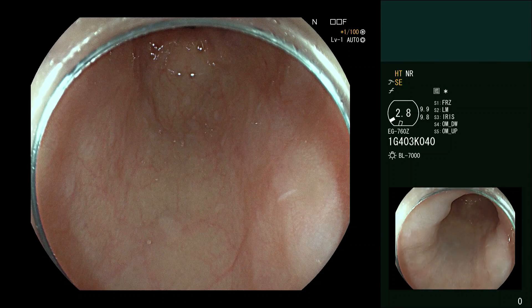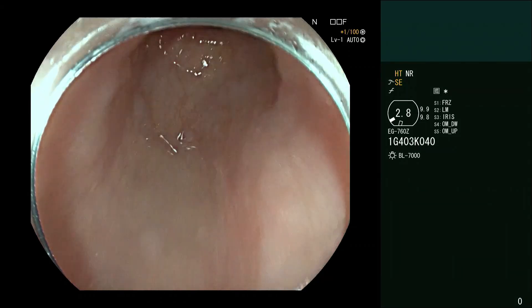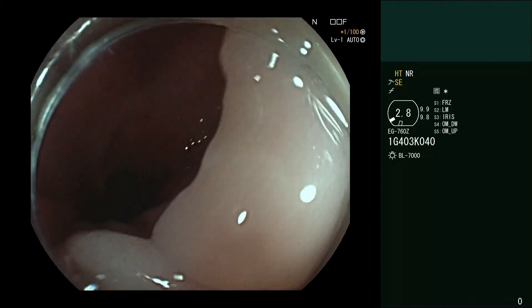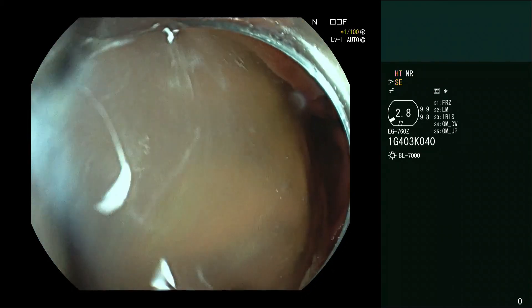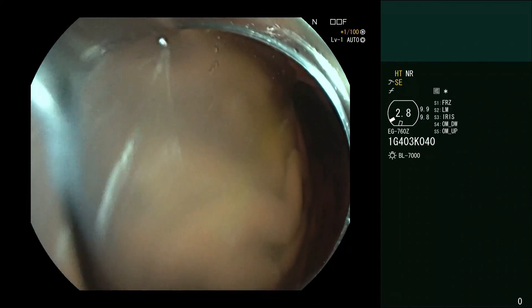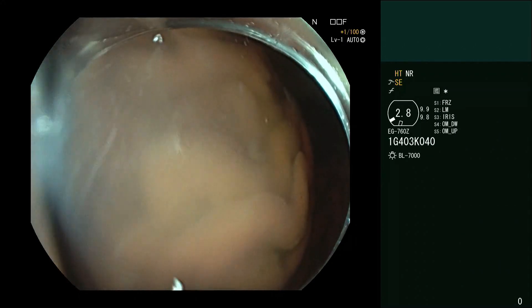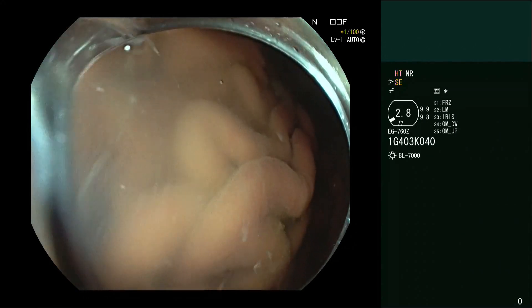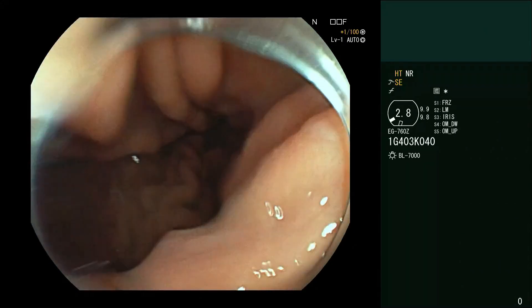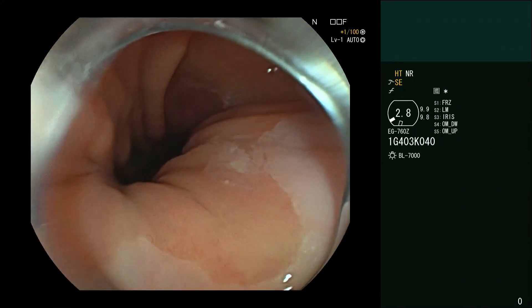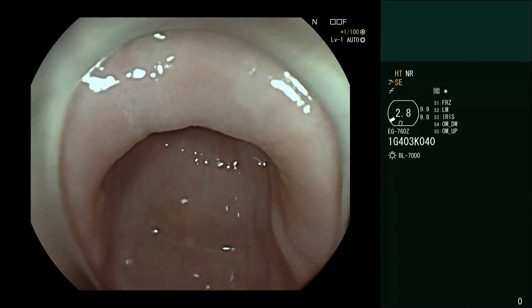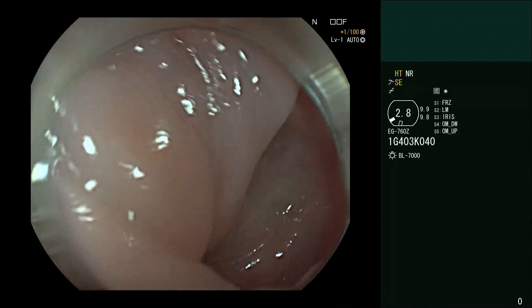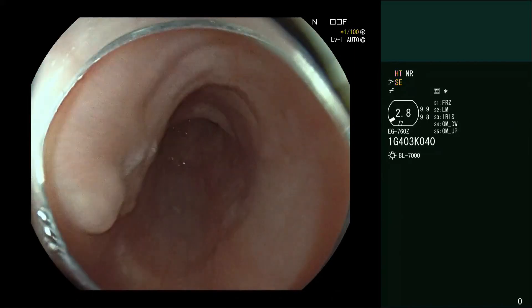Welcome. We're going to show you an esophagus that has been treated with POEM, per oral endoscopic myotomy. I'll chat to you about some of the features you can expect to find after, but also some of the features you can look for when your patient after such a procedure, or even before, says they still have problems.